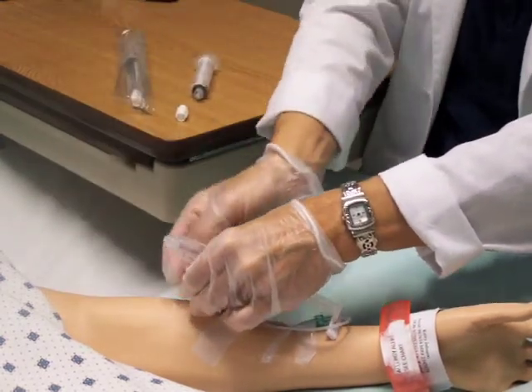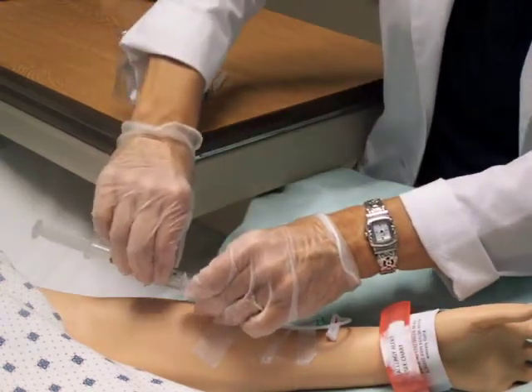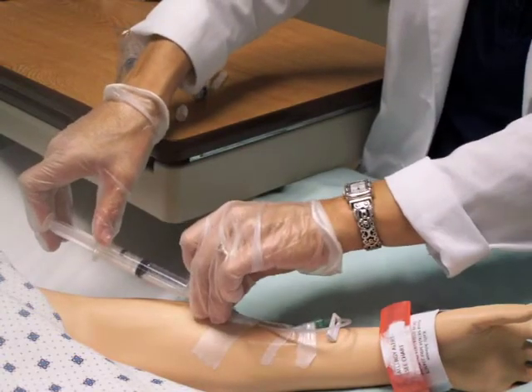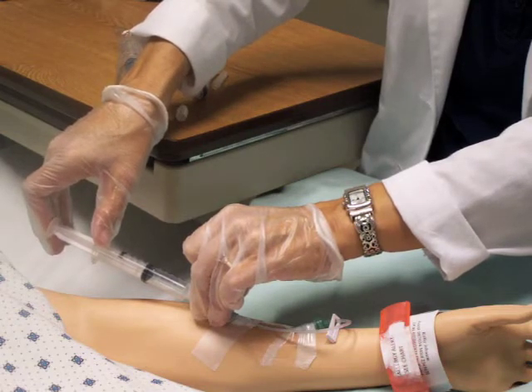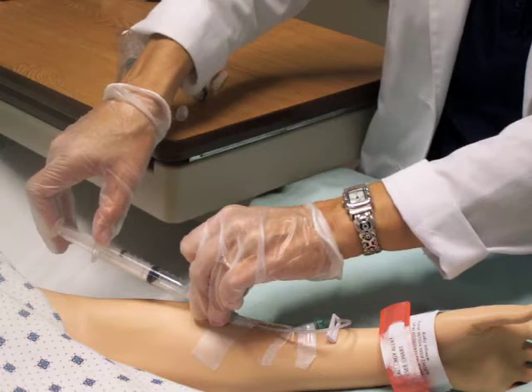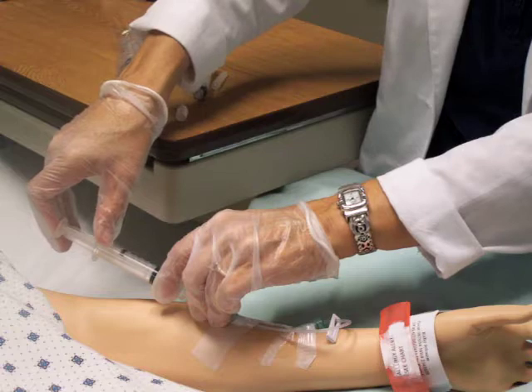Dispose of syringes in appropriate receptacle. Do not recap. Flush with the appropriate amount of saline at the same rate as the medication was administered. If applicable, flush the port with 2 to 5 milliliters of heparin, 100 units per ml, using positive end pressure while clamping the port. This maintains patency of an open-ended catheter.